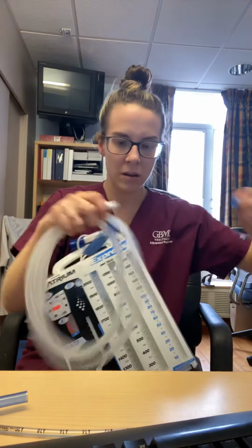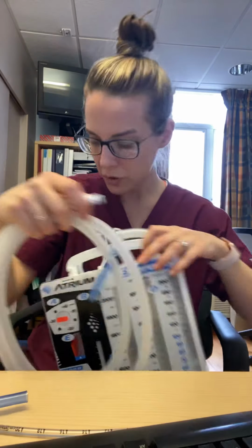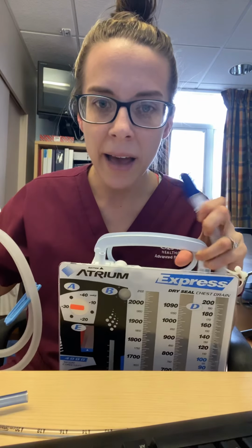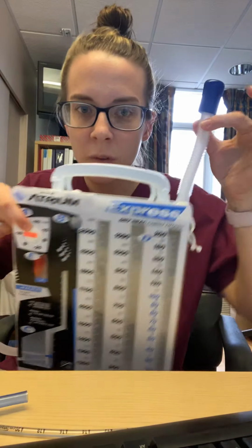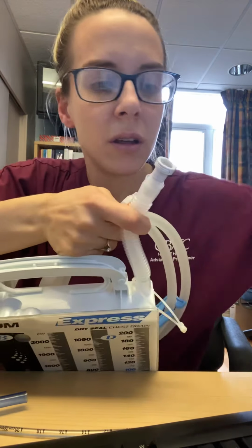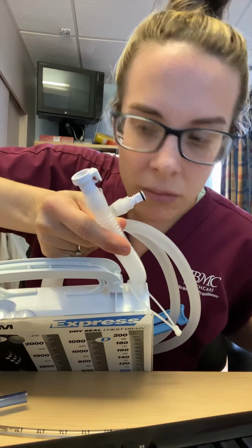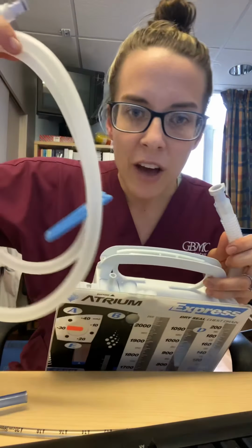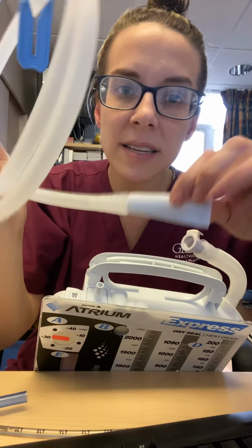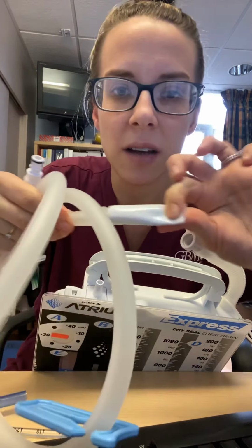All right. This will already be set up for you, so you don't have to worry about it. But okay, so when I take this out of the packaging, this is the atrium with this little hose type thing. You can take this blue cap off and you have this little connector piece. And now I have my Pleurovac tubing with a blue clamp. You can take this off.